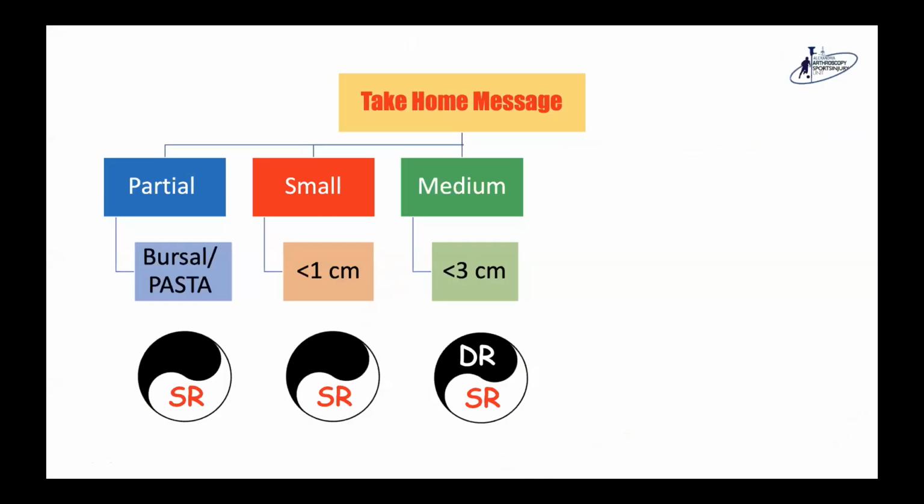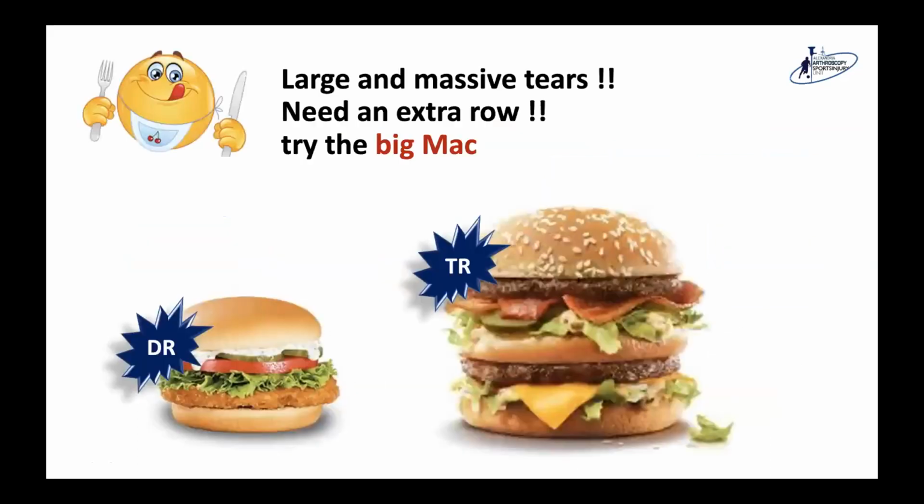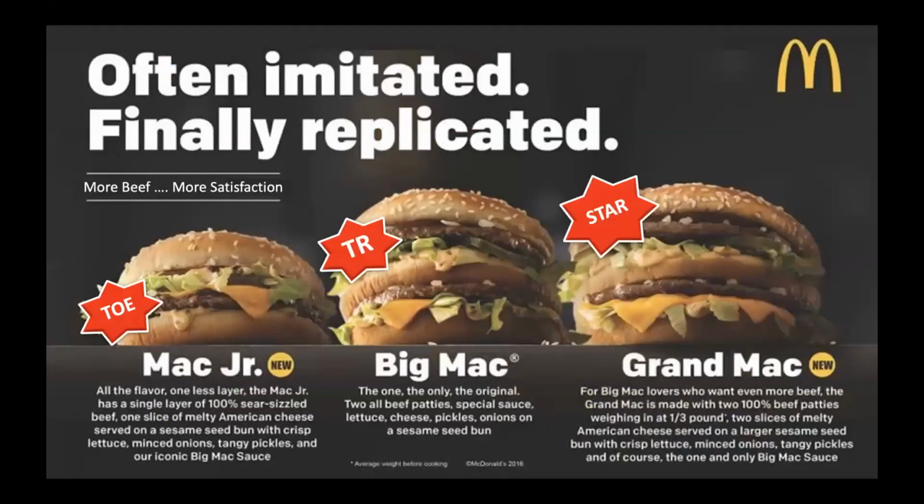So the take home message, with treatment of different cuff tears: with partial tear you can do single row, small tear you can also do single row, with medium tear you have the option of single and double row, but with large and massive tears, either double row or the newly described STAR triple row modification. This is because large and massive tears usually need an extra row, so try the Big Mac, or our modification with the STAR repair.